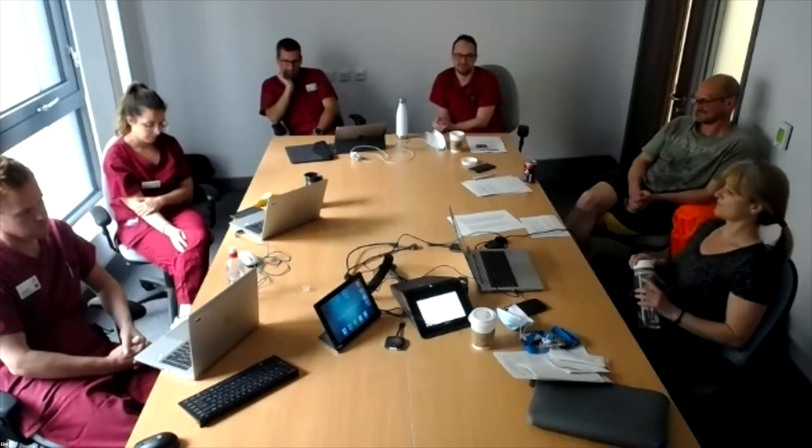Professor Van Herk has a question. He says, interesting that setup and review takes quite so long on protons. Have you compared to similar pediatric setup on photon machines, and why is it different? No, I haven't yet. I think the reason why these setups and imaging took so long was because it was a new service, and there was lots of uncertainty with everyone there about the dosimetric impact of what we were seeing on the cone beams. So we had to get a lot of help to make those decisions about whether to go ahead for treatment or reset up.